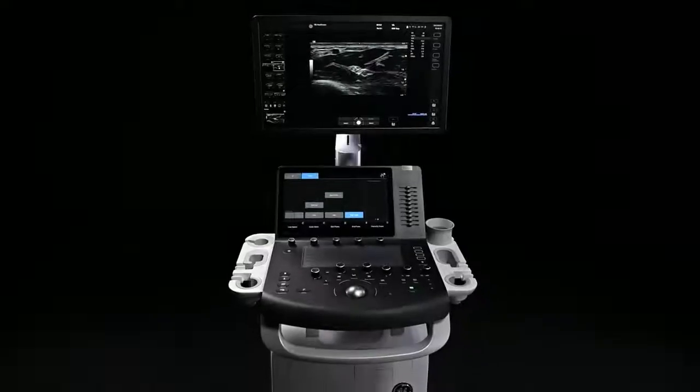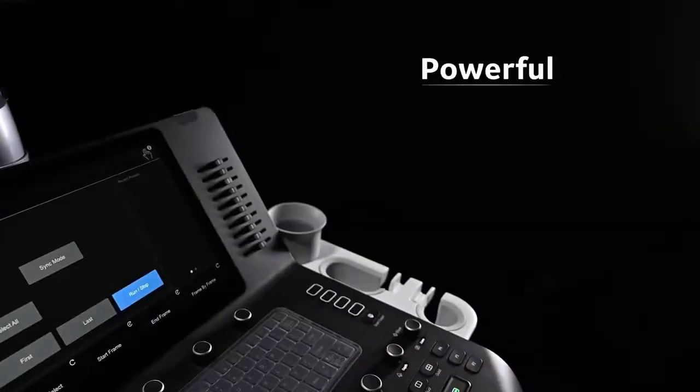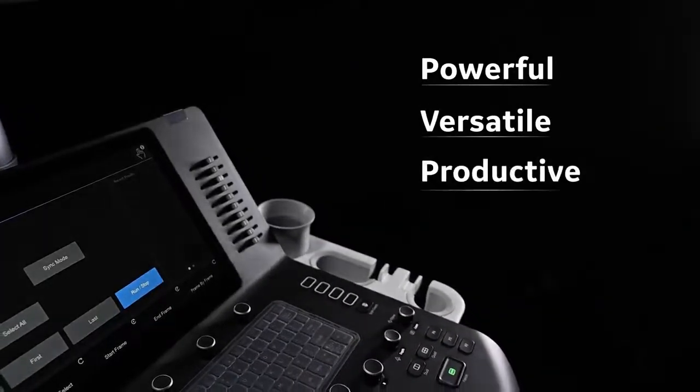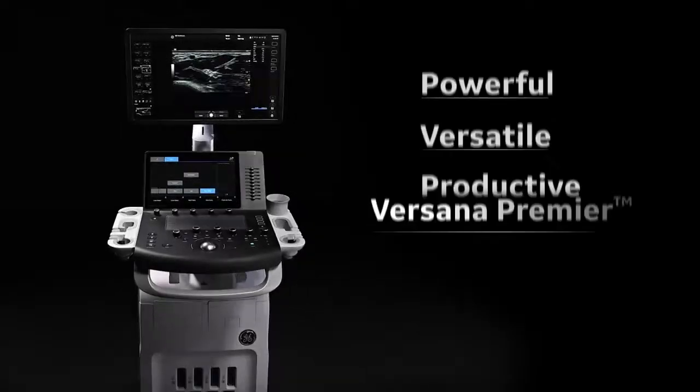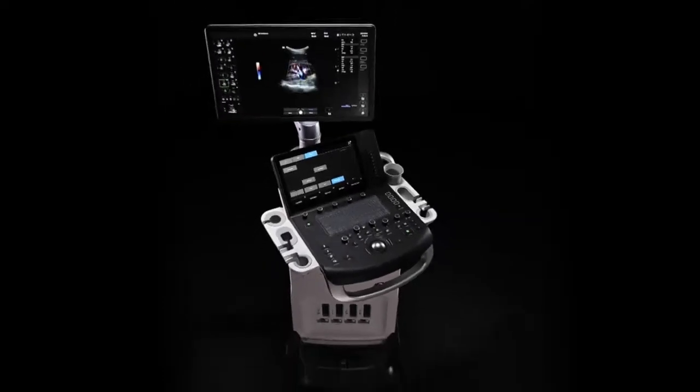We asked urologists what they needed from an ultrasound system, and they answered. They need an ultrasound system that's powerful, versatile, and productive. Introducing the next generation of Versana Premier, newly upgraded to help you elevate your diagnostic capabilities in urology.